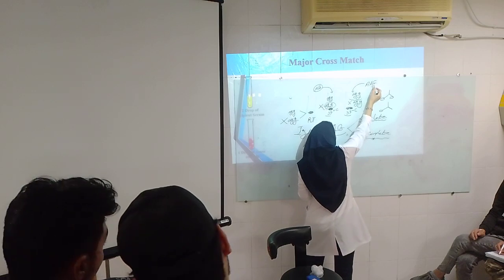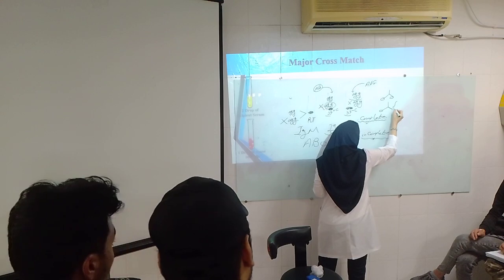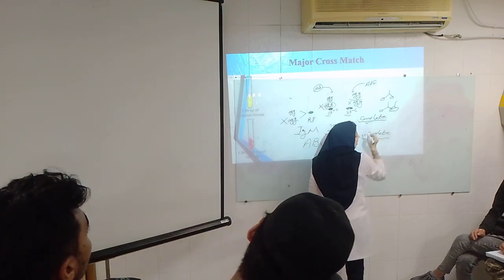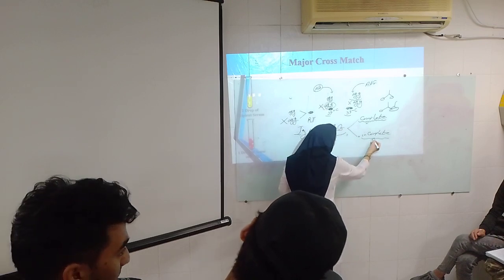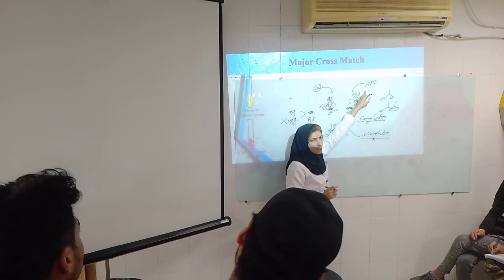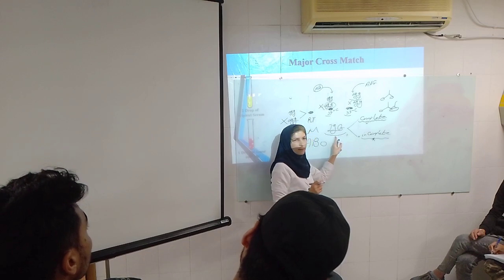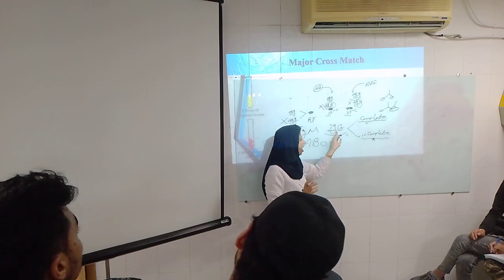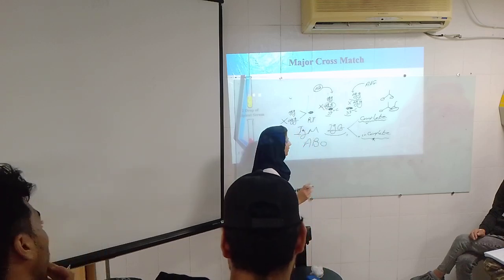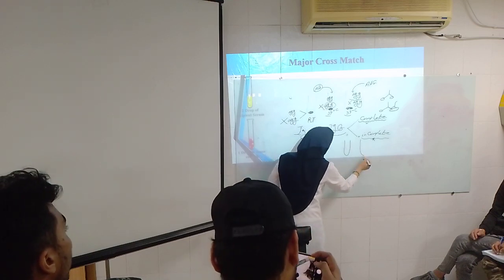Just when you add another antibody, it comes and attaches to this antibody, and now this antibody can attach to antigen, and now you can detect the incomplete IgGs. In the third tube, we add this material for helping to detect weak, unexpected, warm antibodies like incomplete IgG. Okay, now we do the cross-match test. At the end of the time, we have 3 tubes.